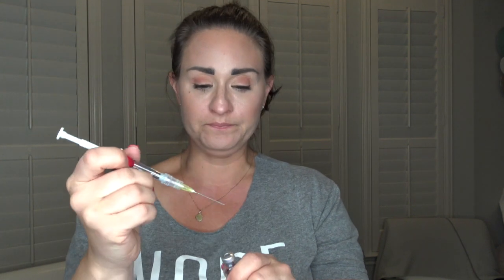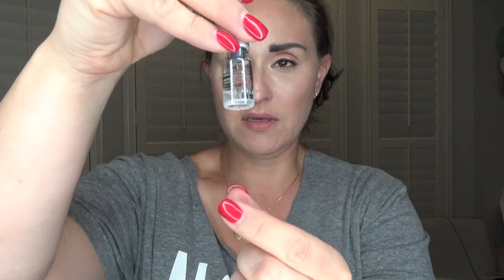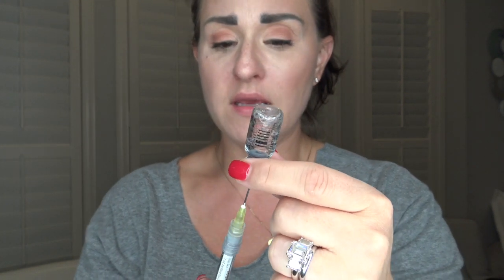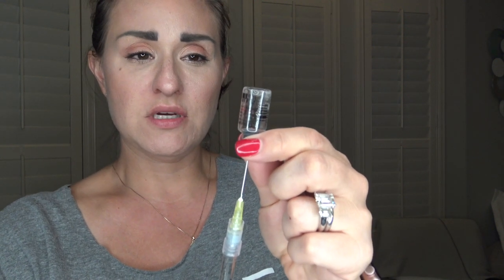Big and scary, right? This needle isn't going anywhere near you. However, get used to needles that look like this, because once you get to progesterone in oil, this is how big your needles are going to be. Inject the needle into the bottle and inject the water in, and allow the medication to simply mix around. You can see now that all of the powder has liquefied.